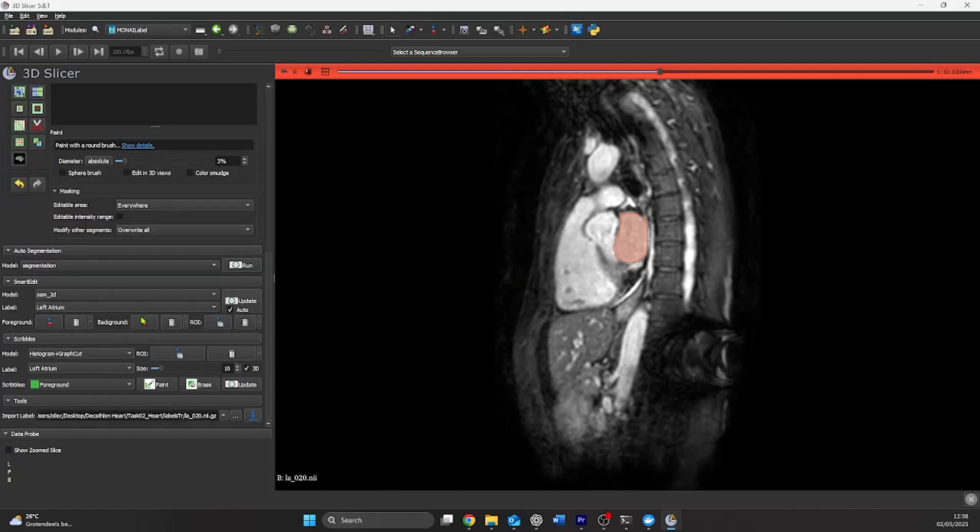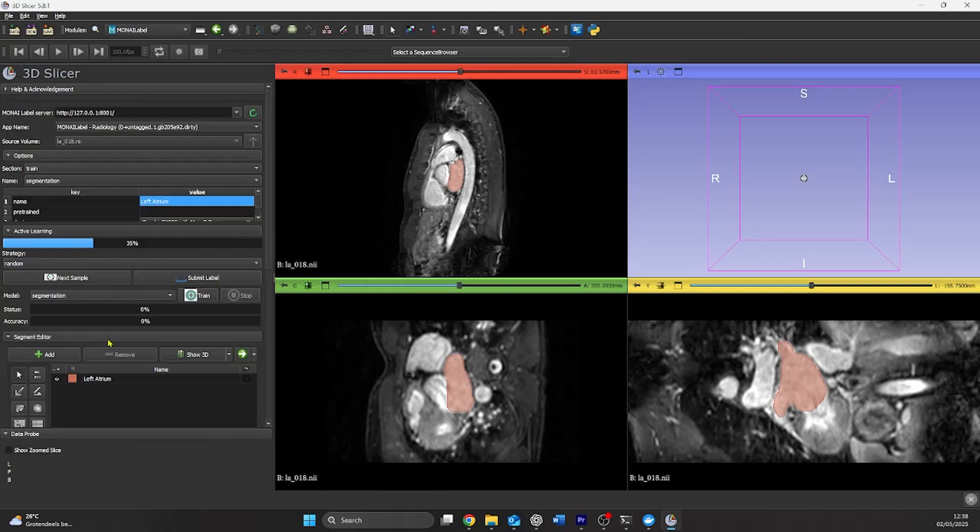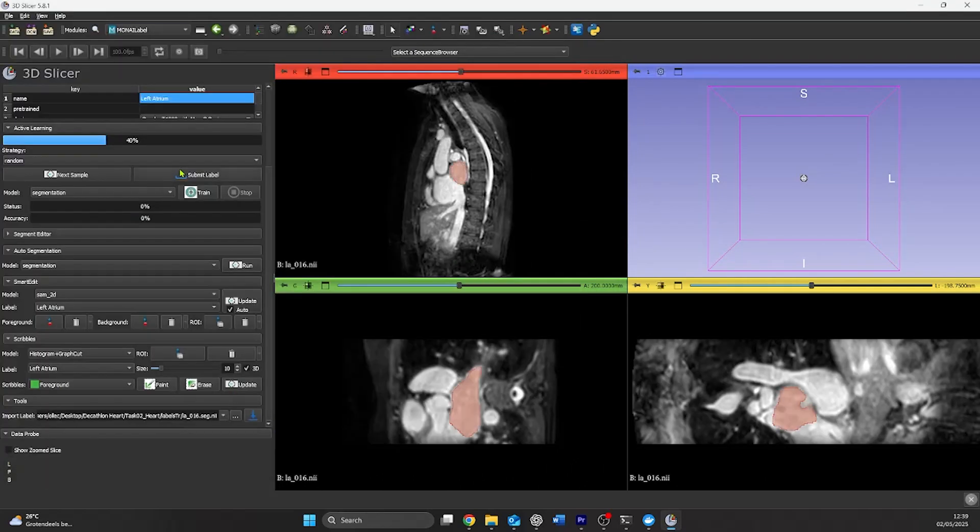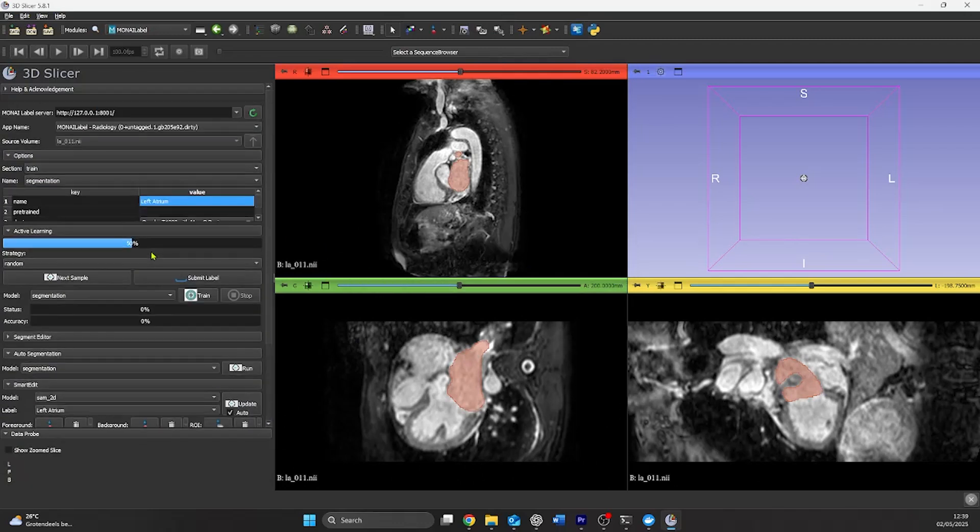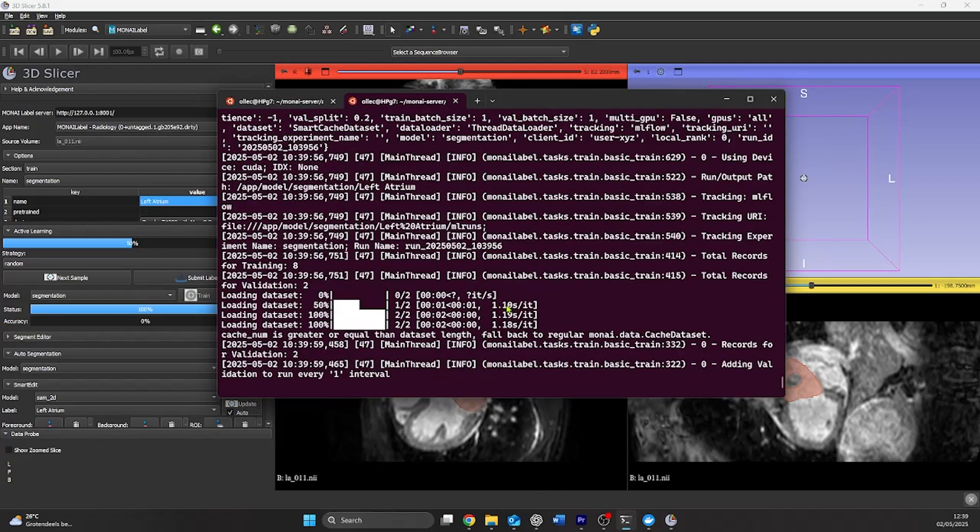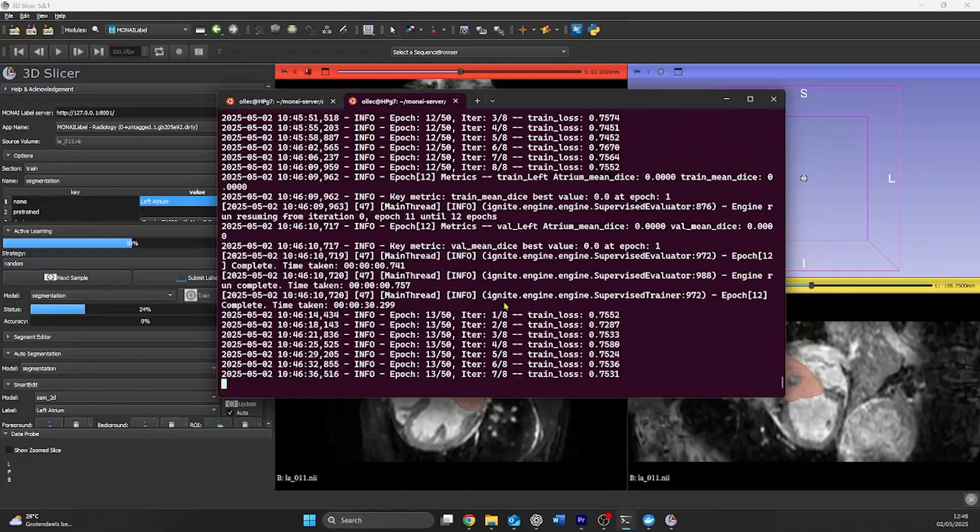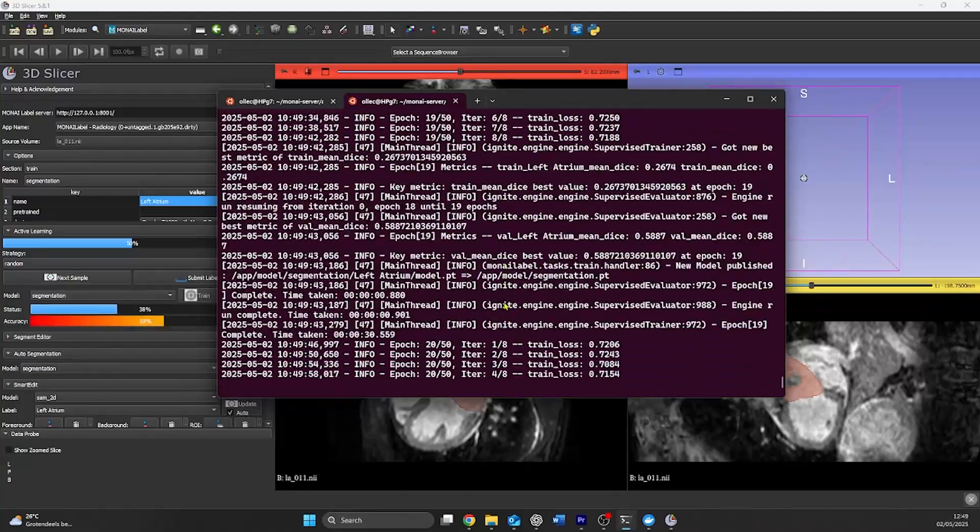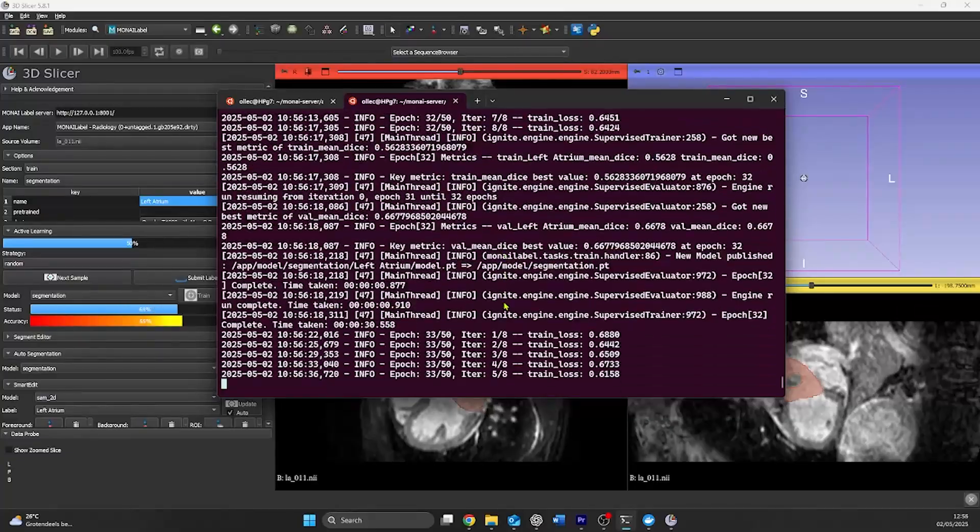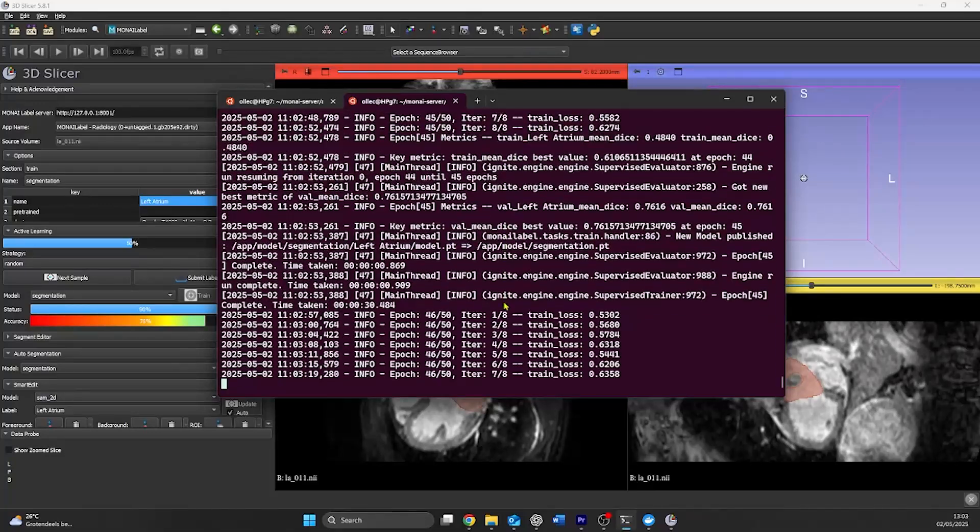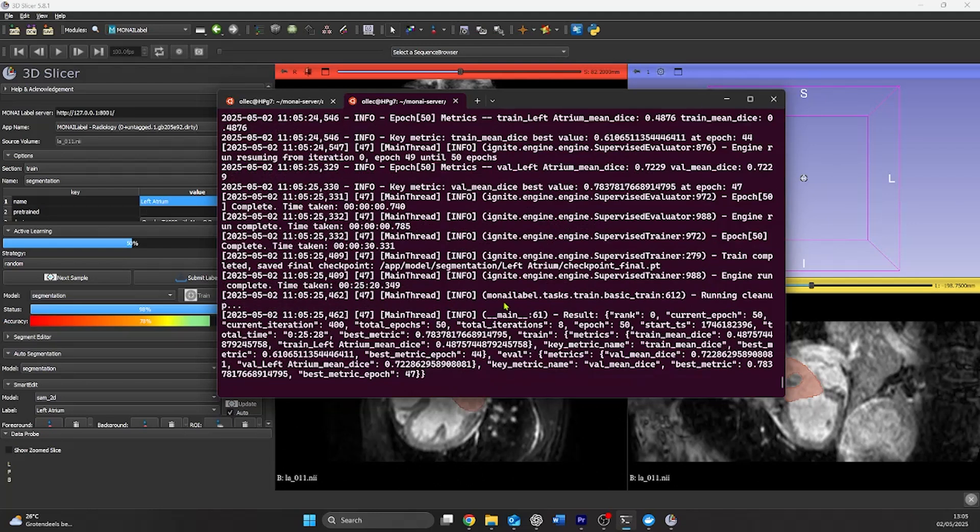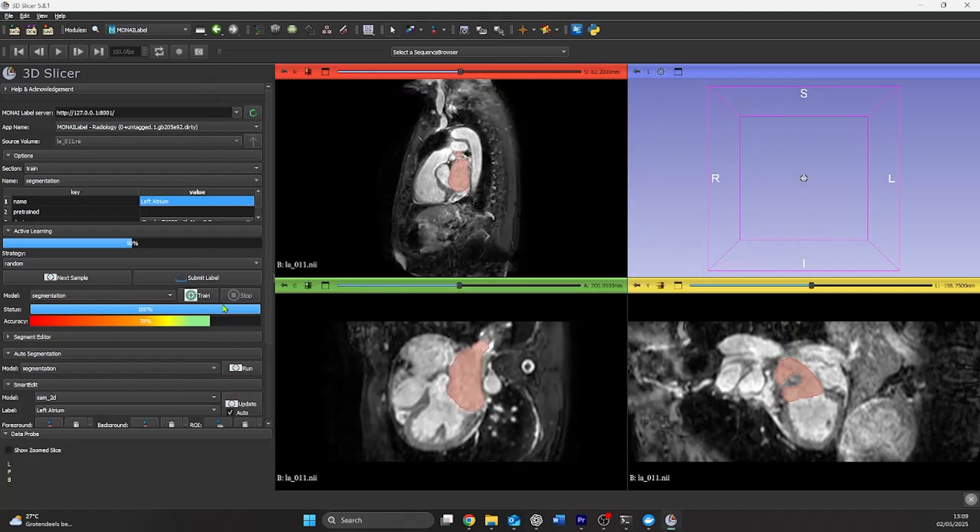And after we have given the server enough data to work with, we can start training our model. We press the button train. And in our WSL environment, we can now see that it's training the model. Depending on your GPU, you will have different speeds. Also depending on the amount of epochs that you're running, in this case 50, you can get better or lower accuracy. The accuracy that slicer shows is due to the fact that out of every five data points that you submit, so matched label and image, it'll take one to test it on and see how close it is to the label that you have uploaded.